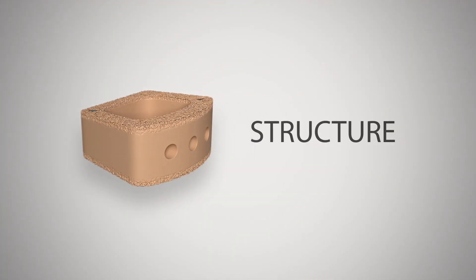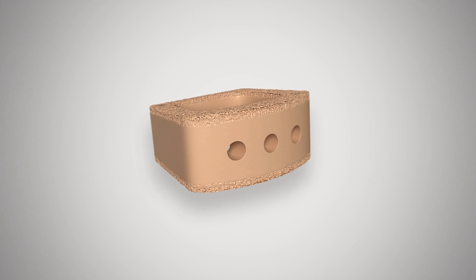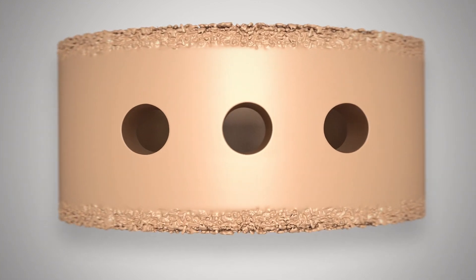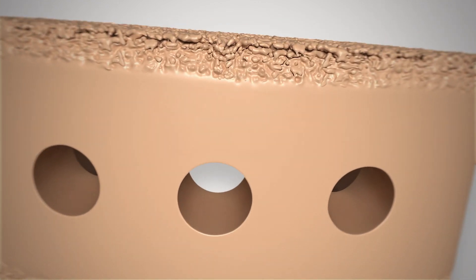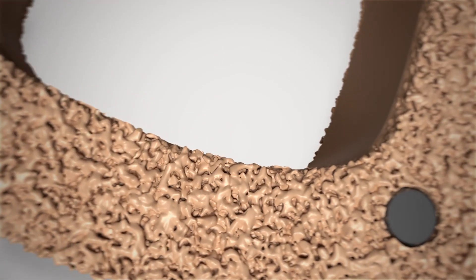Porous PEEK is manufactured through a proprietary extrusion process, which produces a unified porous-to-solid structure that mimics the cortical-to-cancellous transition of bone.